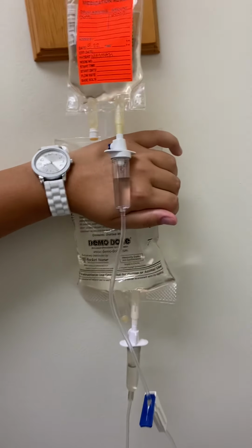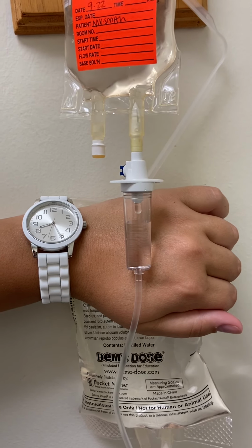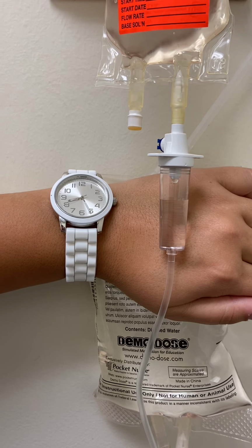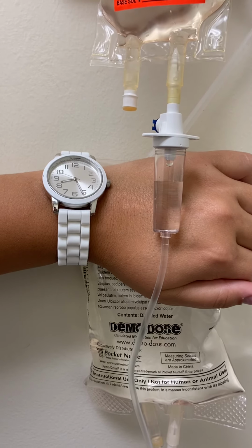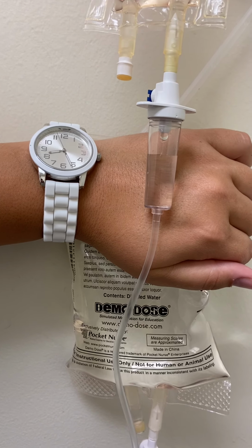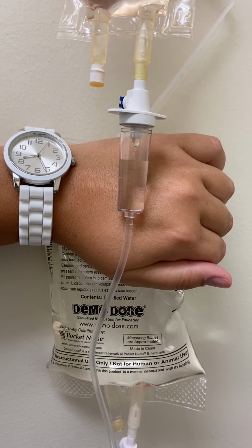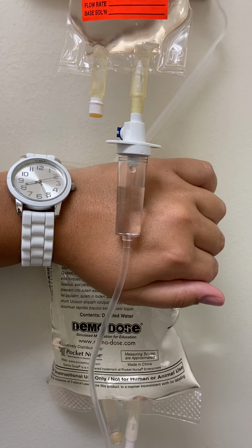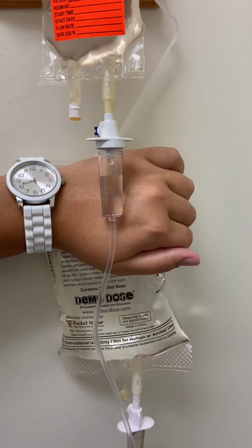Alright, I'm gonna go ahead and count for a full minute. Okay, so that was a little more than 17 drops a minute. So I'm gonna readjust it and then restart now.